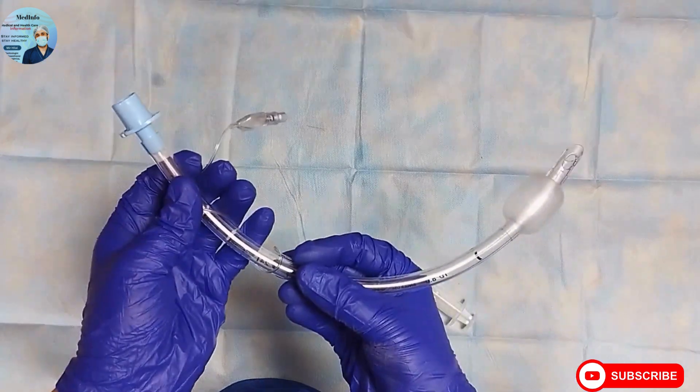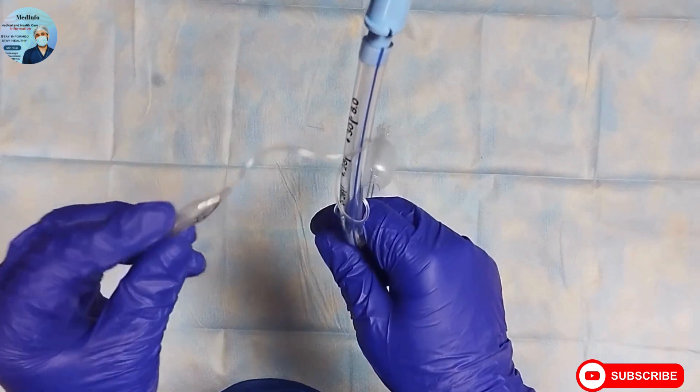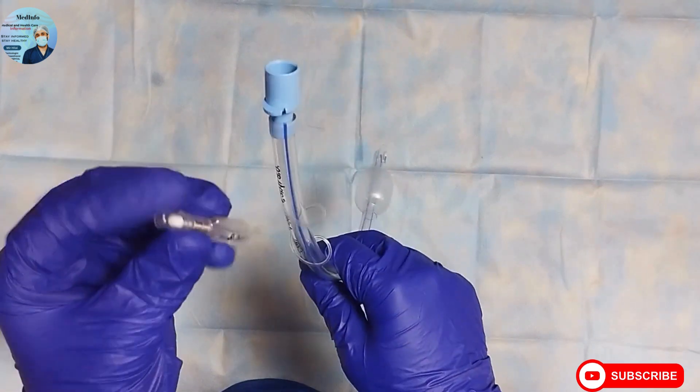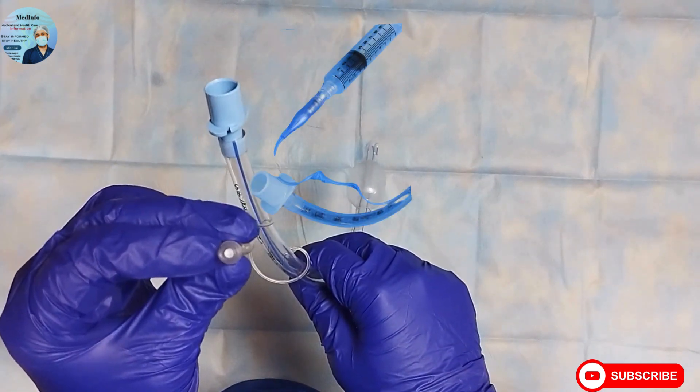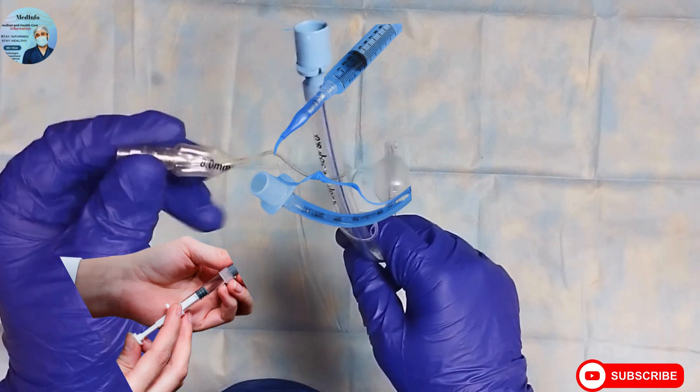To deflate the cuff during the extubation process, you just need to press the valve of this pilot balloon with an empty syringe and aspirate the air back.